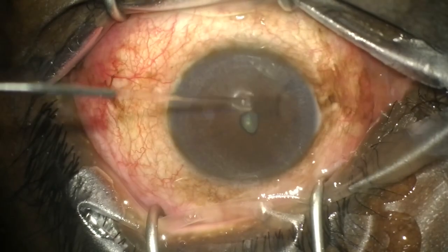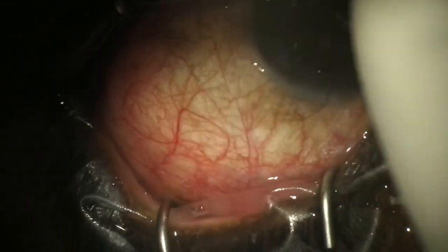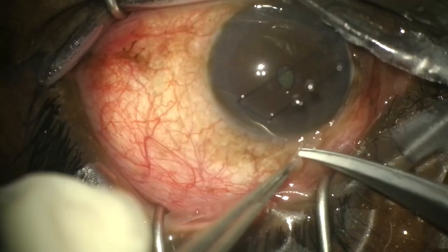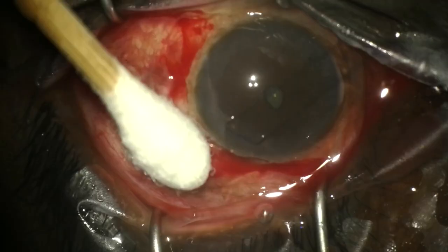This is the use of the Eye Plate 300S. We start off with a 7-0 silk corneal traction suture to infraduct the eye. We're now going to open up the conjunctiva and create a 180-degree peritomy.